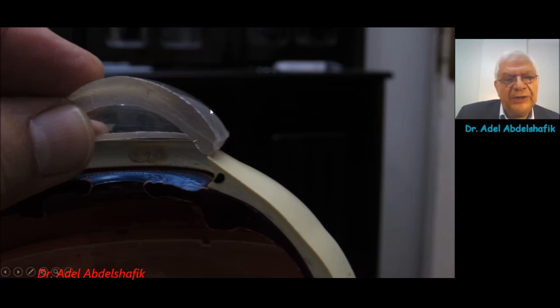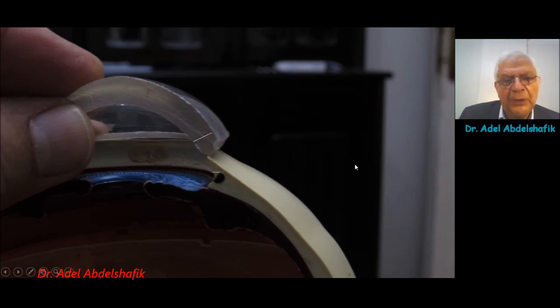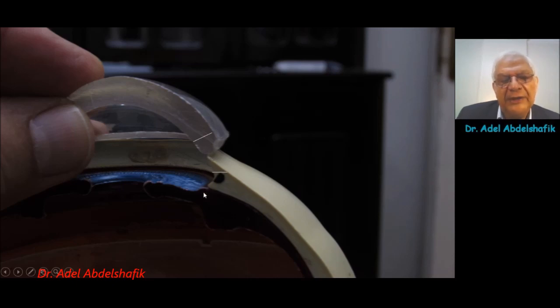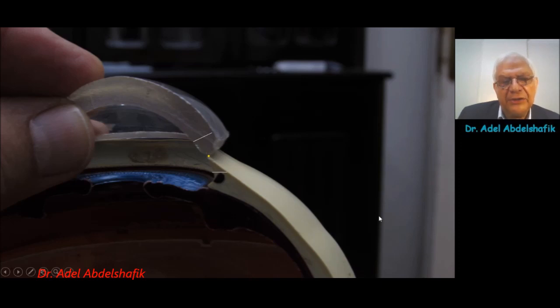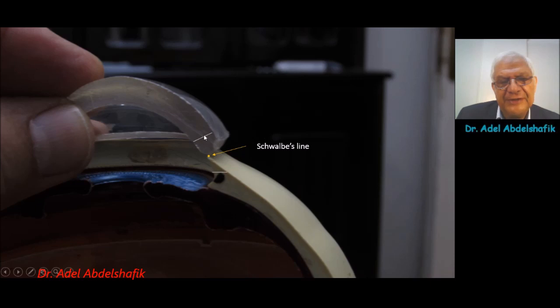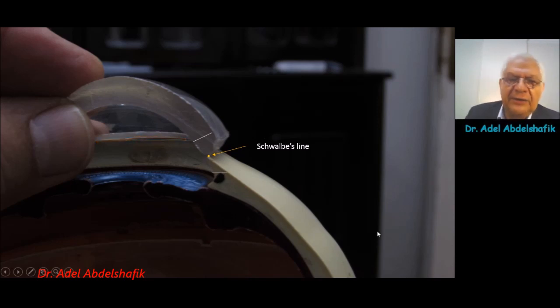This is the cornea. In a section of the cornea on a slit lamp, you're going to see inner and outer surface and in between translucent tissue. On the other hand, back here in the area of the trabecular meshwork and the scleral zone, you're going to see only the inner surface. This is the location of Schwalbe's line — between the cornea with inner and outer surface and translucent tissue in between, and the sclera which is opaque. This is the extent of Schwalbe's line.